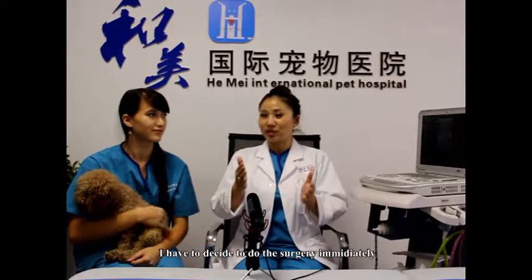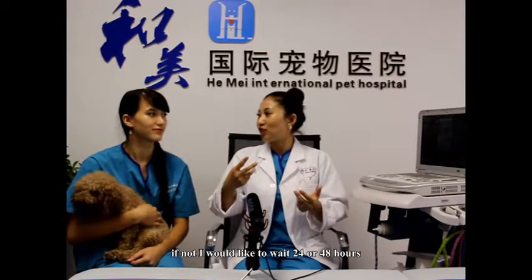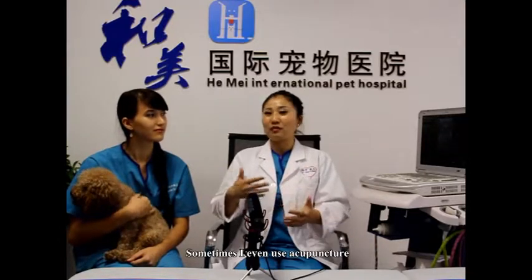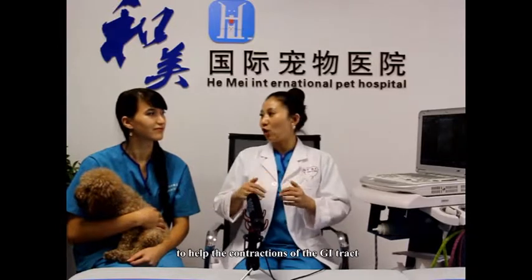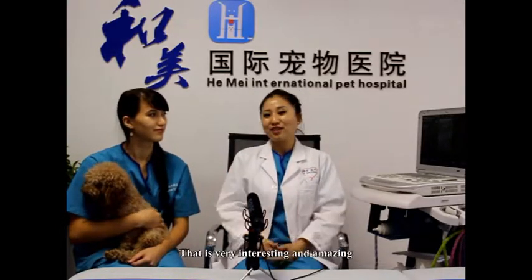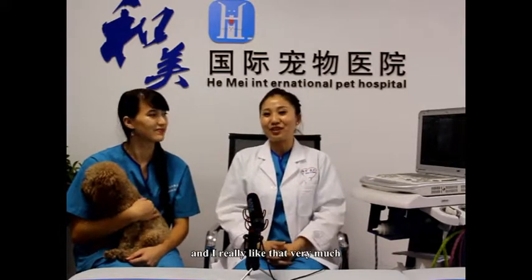If it is blocked there, I have to decide to do surgery immediately. If not, I would like to wait 24 or 48 hours to see how it moves down. And sometimes I even use acupuncture to help the contraction of the GI tract, to help the foreign body move. That is very interesting and amazing, and I really like that very much.